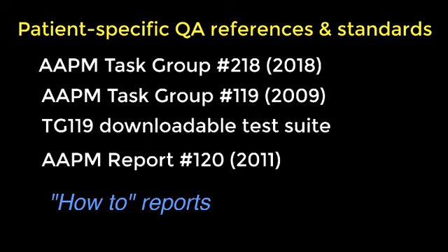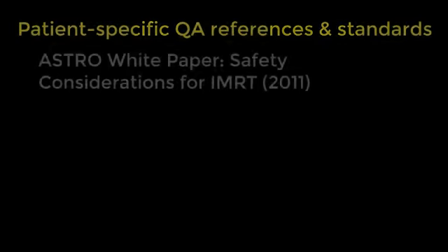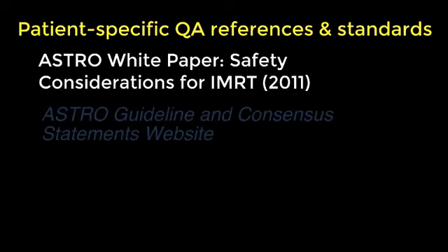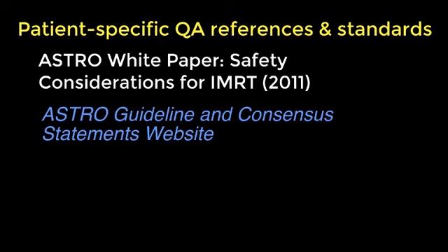There are also some other reports from other professional societies. And here's one, the ASTRO Safety White Paper on IMRT, published in 2011. That's part of a general series of guidelines and consensus statements from ASTRO, and here's a link to the website.